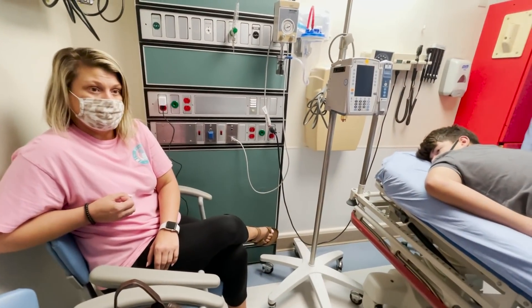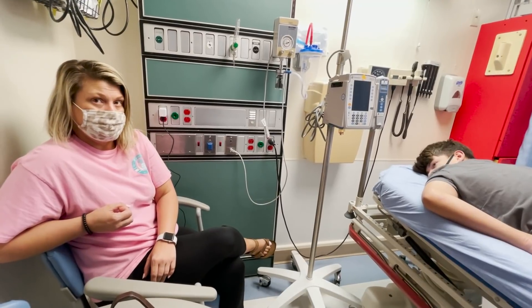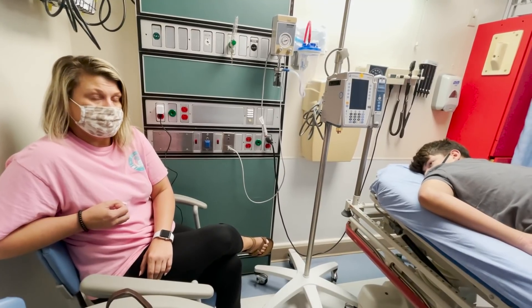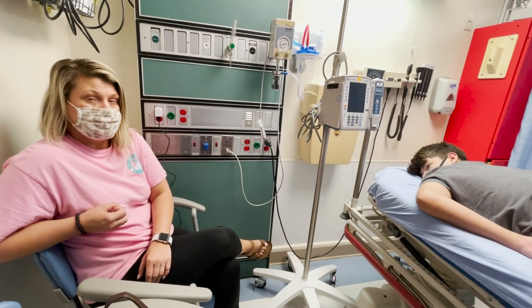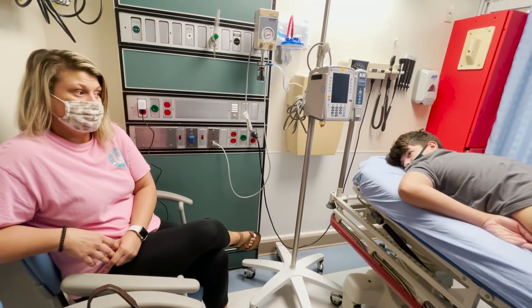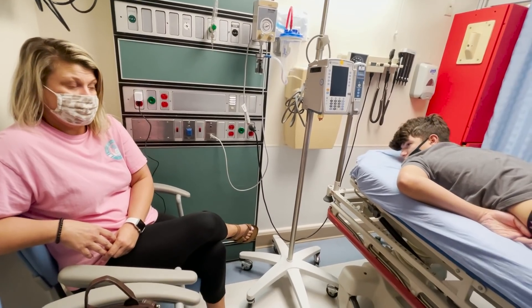The procedure I'm going to do is inject right at that location with a steroid and a numbing medicine. If I get the right spot, it will very quickly resolve — he'll go out of here completely pain-free. The pain is constant, just constant, but really worse when he moves.